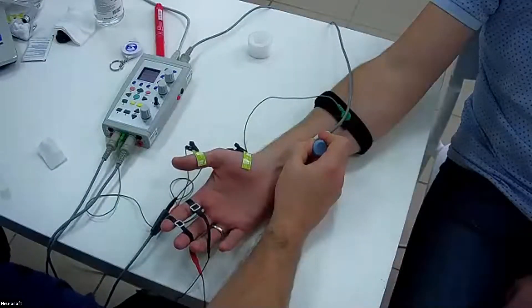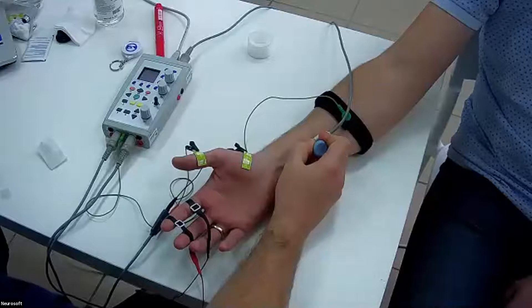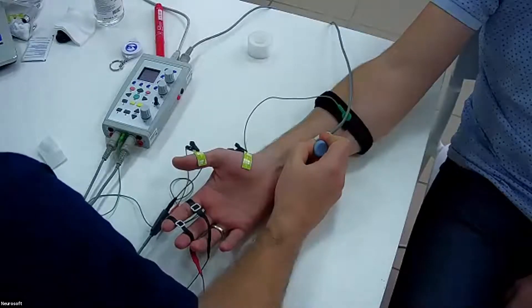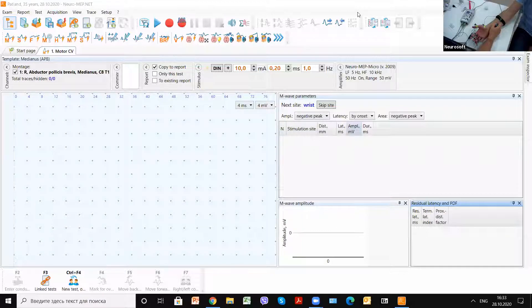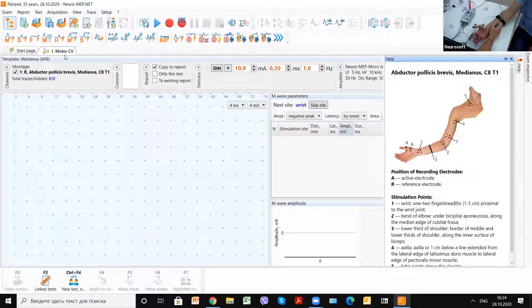I will share the screen. As mentioned, you can use the help screen for basic probe guidance. You can see the position of the recording and stimulation electrodes as we set them. When we open the motor conduction velocity window, we can see we are recording the medianus nerve on the right hand.